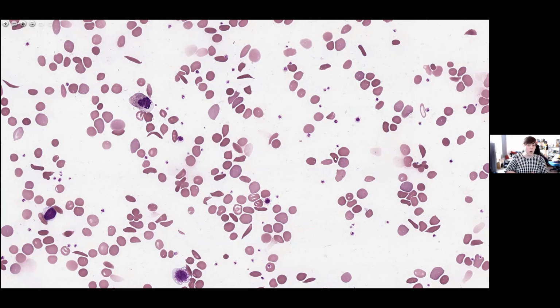Sickle cell on its own should not be hypochromic microcytic. So in the absence of iron deficiency, you should see this type of classical picture. A beta thal with a sickle, you can still have sickles on the film. In my experience, you have less, but that's not a hard and fast rule. You should see, in a beta thal, hypochromic microcytic nucleated reds.